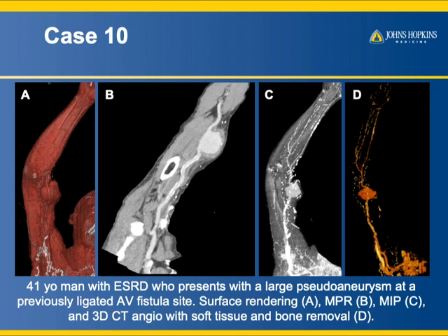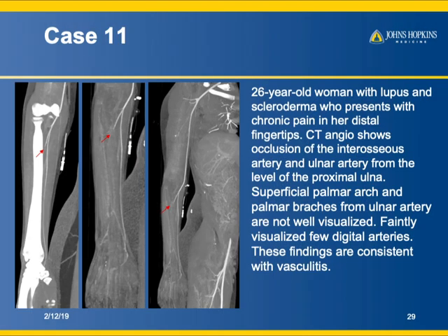A patient with end-stage renal disease has a large pseudoaneurysm. Many of the patients we show are not trauma patients — they are complicated cases who've had catheterization procedures, AV fistulas, or grafts placed. Something has compromised the vessel, and these are the resulting complications. A 26-year-old with lupus and scleroderma presenting with chronic digital pain demonstrates interosseous artery and ulnar artery occlusion, poorly visualized superficial palmar branches, and faint digital branches — this is vasculitis.